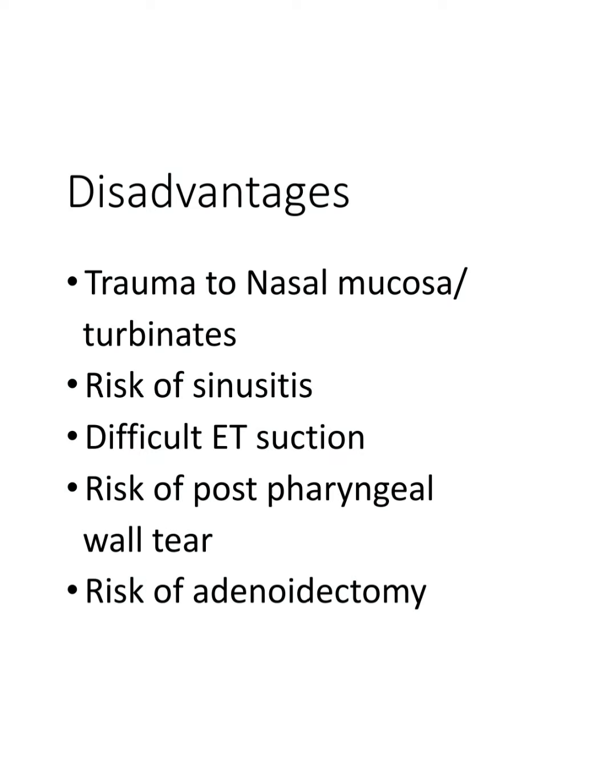The disadvantages of nasal intubation are the likelihood of trauma to nasal mucosa and turbinates during intubation, risk of sinusitis, difficulty in endotracheal tube suction, and risk of pharyngeal wall tear and adenoidectomy during intubation.